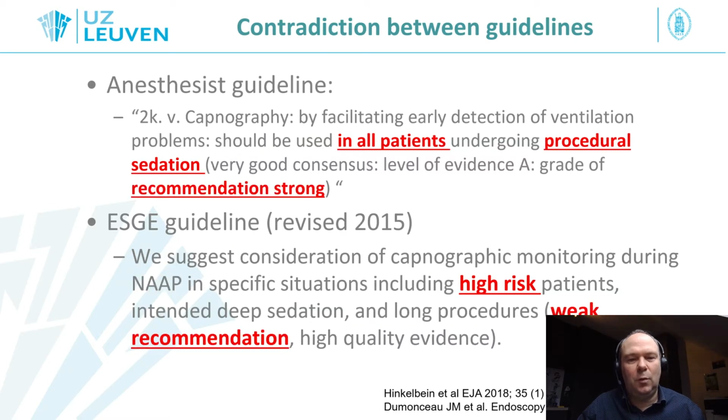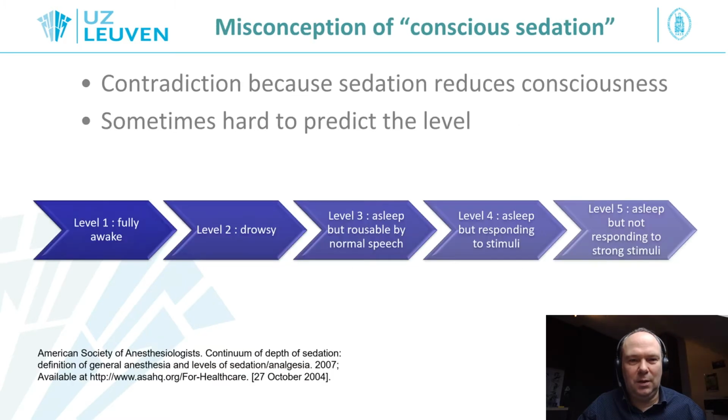So on the one hand, we have a strong recommendation to use it in all patients for procedural sedation. And on the other hand, there's a suggestion to only use it in high-risk patients, long procedures, or deep sedation. So when we were discussing the introduction of this in a hospital, we were a little bit in doubt about this.